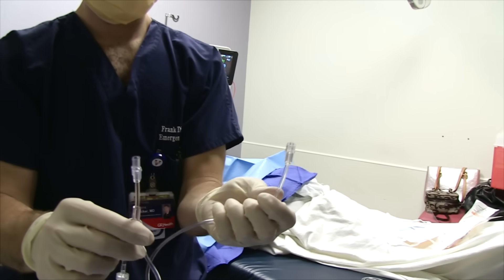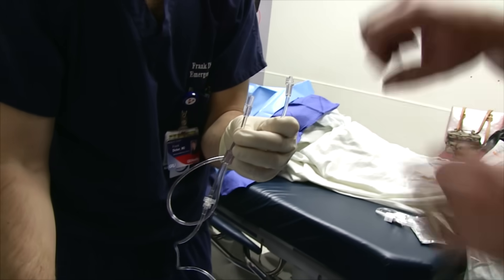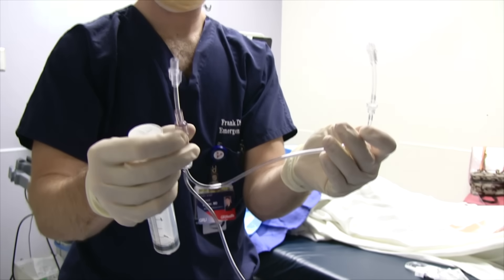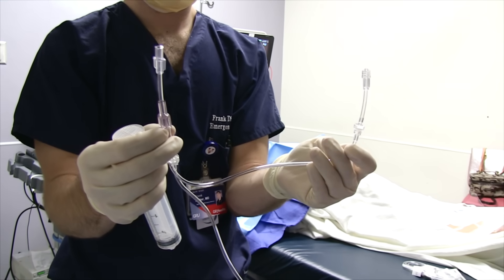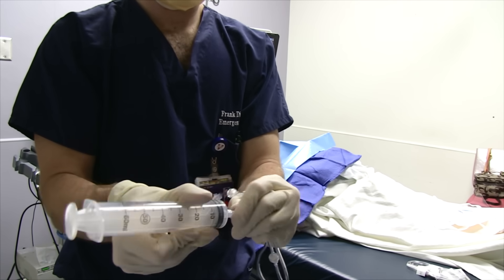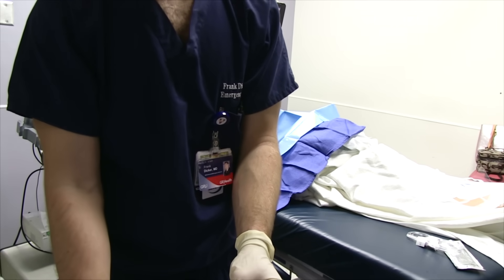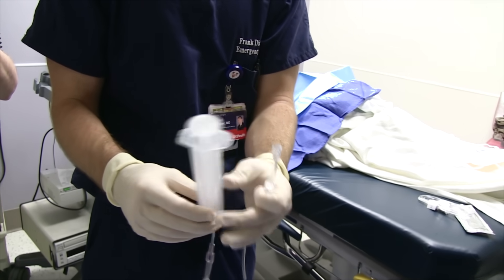This Luer-lock is going to connect to the pigtail catheter that you leave behind. When you pull up on the syringe it's going to suck fluid through one one-way valve, and when you press down on the plunger it's going to push it through the other one-way valve into the bag. So you pull up and down, up and down — once that's all hooked up you can set it to the side.